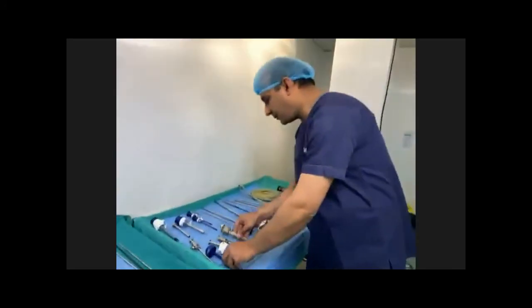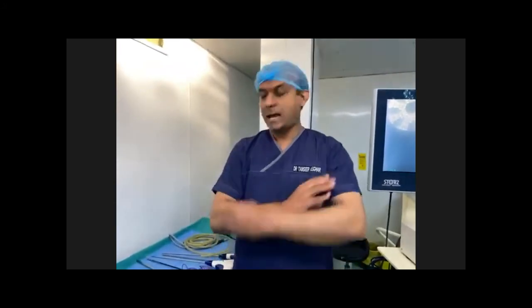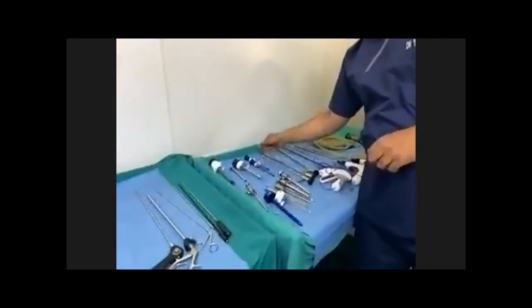Okay, so this is a general brief description about the ports. I am repeating that the most commonly used instruments in basic laparoscopy are 10 or 11 mm ports and 5 mm ports in general surgery and in most of the gynecological and urological surgeries. The 3 mm ports are also used in pediatric surgery patients. So there are a few more instruments which are related to this.